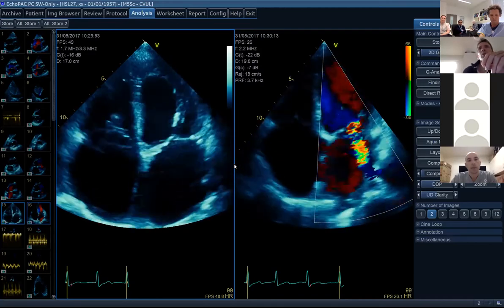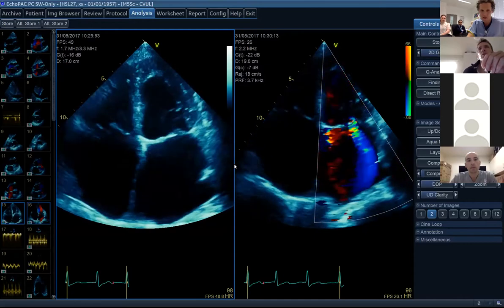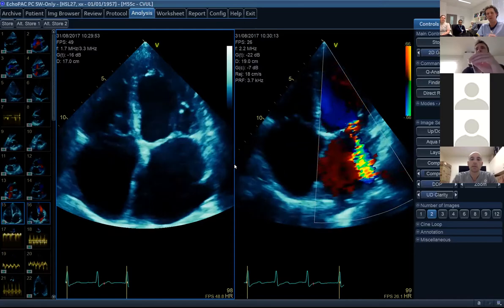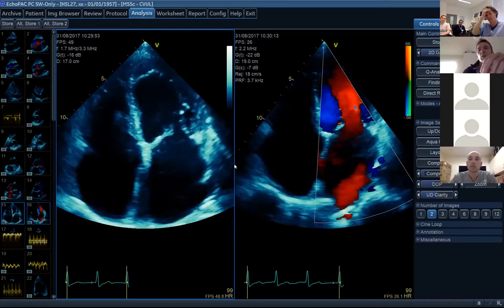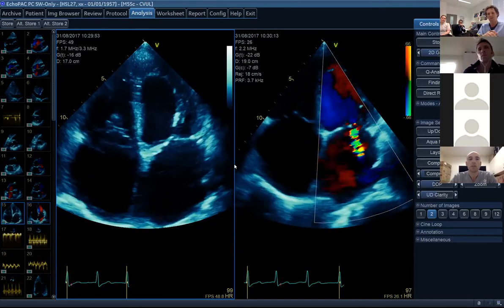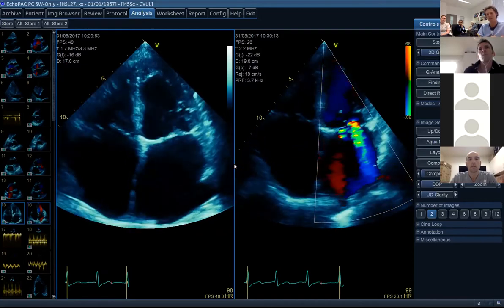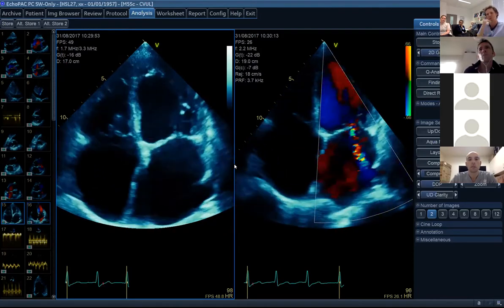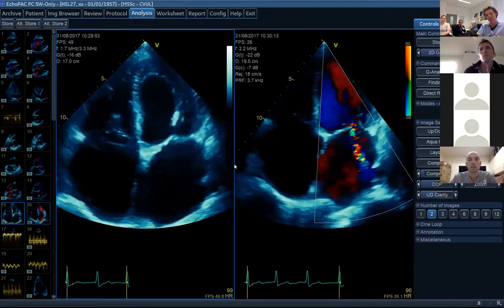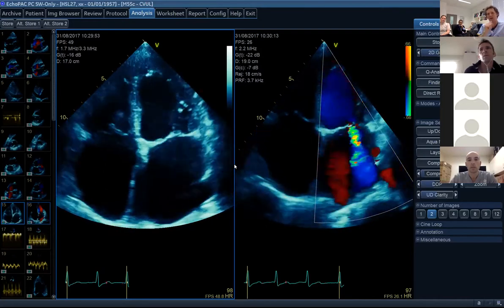Well, you told me that she's failing ventilation, so difficult to wean from it. Yeah, difficult to wean. Each time we're trying to reduce the PEEP, each time we're trying to reduce the FiO2, we have some difficulty. She becomes tachypneic and things like that. On pressure support, trying to pull the ventilation settings down, tachypnea, and I'm going to say notice the tachycardia. So again, see everything that's going on. She's tachycardic as well.